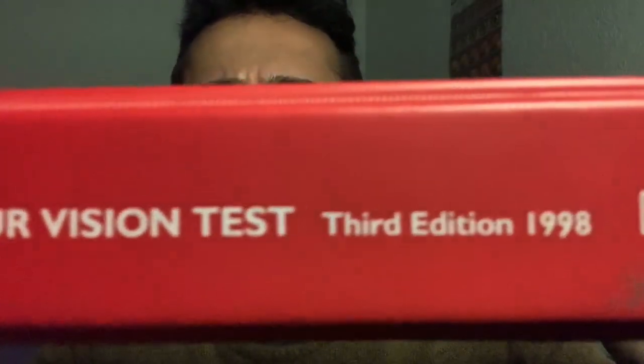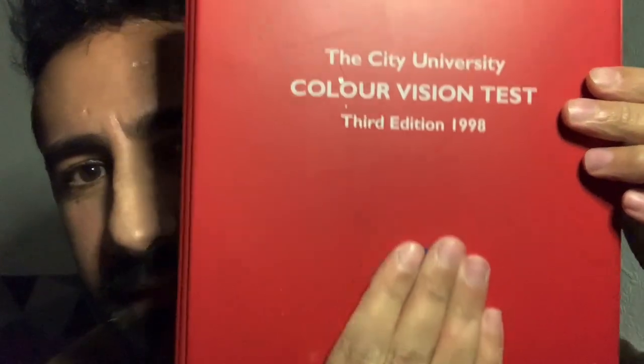The City University colour vision test, housed in this protective binder, is easily identifiable in any optometric practice. It consists of two parts.